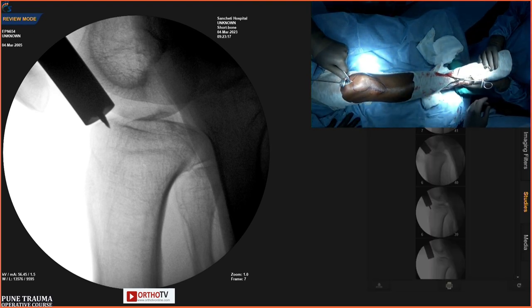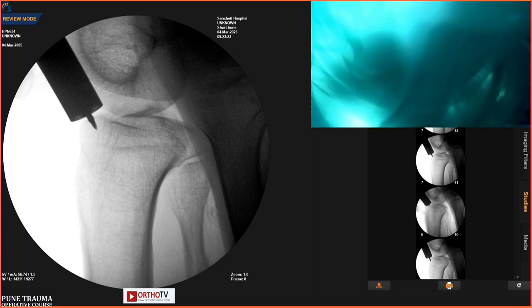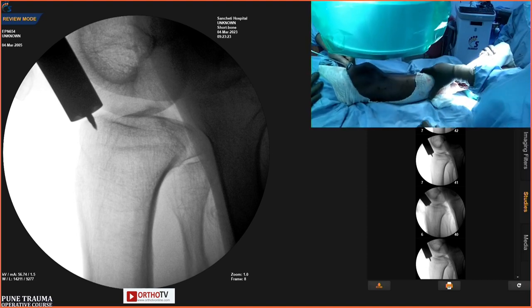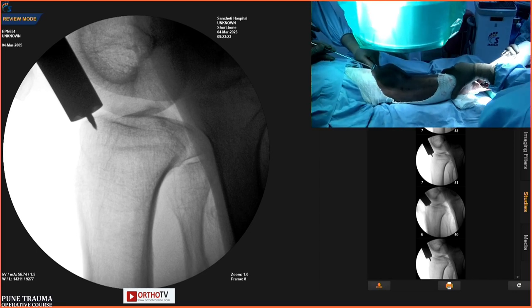This is the upper pole of the tibia. Now we'll confirm in the AP X-ray. In the AP, it should be in the midline or just medial to the lateral tibial spine, but it does not matter very much in the distal tibia, but it matters very much in the proximal tibia.